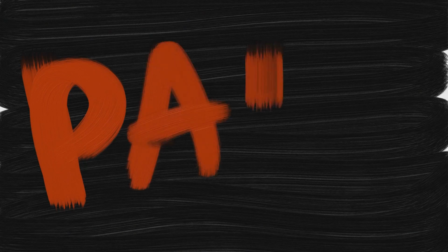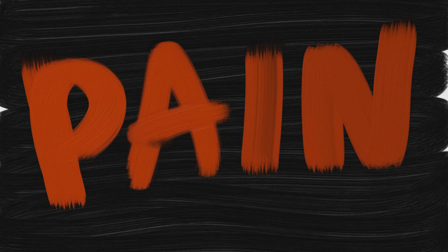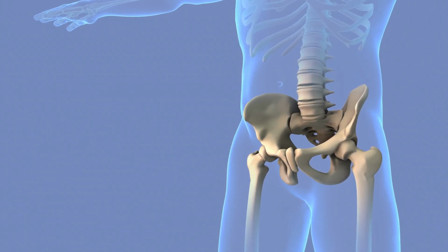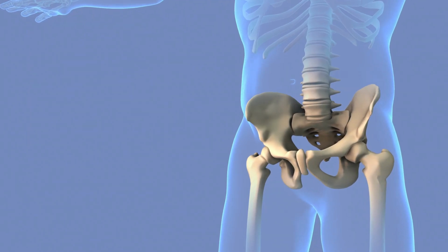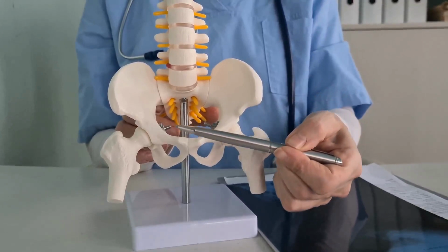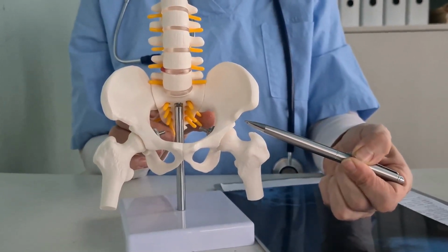Most patients report mild to moderate penile pain after surgery. Some patients can describe severe pain, which decreases in intensity after 3 weeks post-surgery. Most patients describe occasional penile pain up to 12 weeks post-surgery. However, some patients have reported penile pain lasting for several months, and in exceptional cases, the penile prosthesis was removed due to penile pain. If you have penile pain, this will be discussed with the surgeon so that further steps can be evaluated.